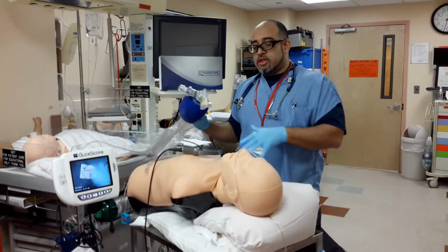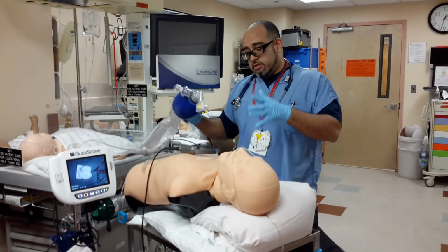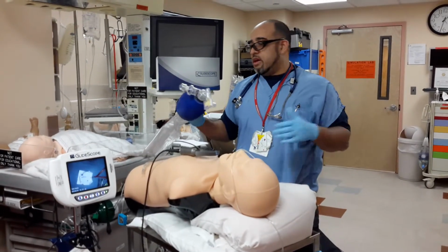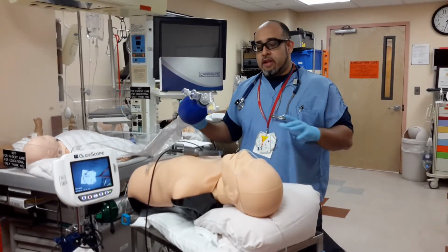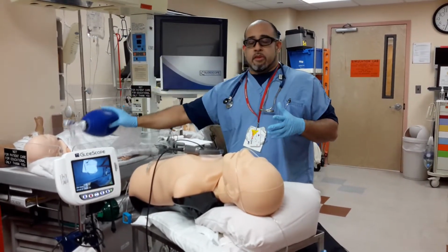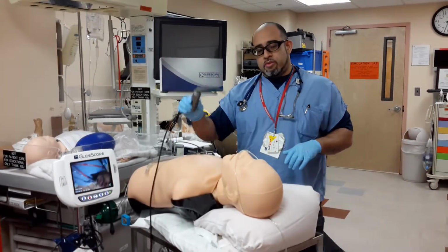Okay, the Glidescope helps me out the best, like in video laryngoscopy. At this time, if I didn't have this, I'd pull out an AirTraq, I'd pull out a King Vision, a VividTrac, a Pentax device. There's so many devices. I'll find the best product available if I need it for the planned or predicted difficult airway, or just for practice to keep my skills sharp in using this new product.